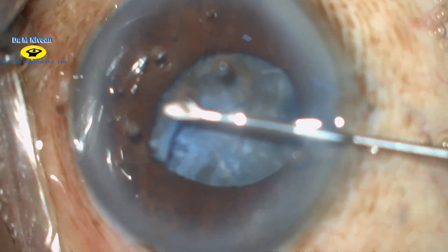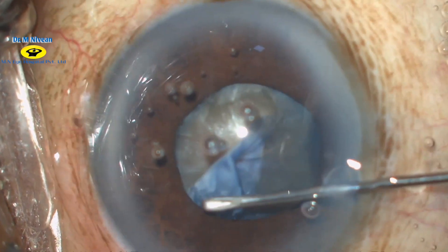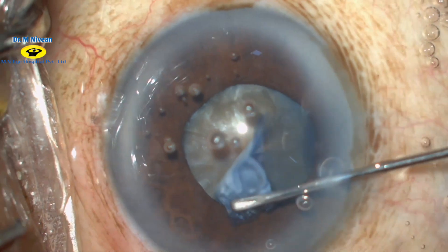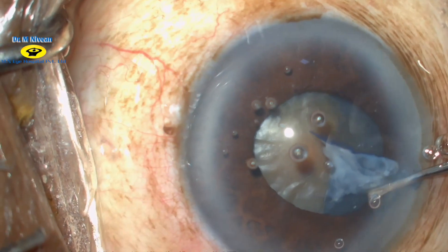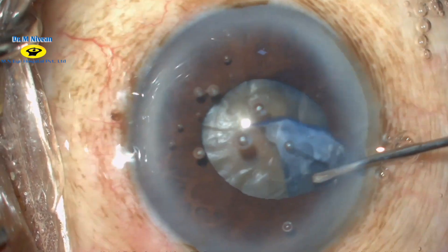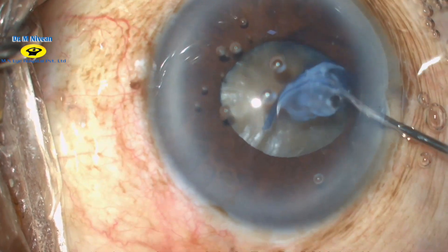As you can see, the capsulorhexis is performed under the iris. This is done to make sure of an adequately large rhexis. Special care should be taken to make sure that the capsulorhexis does not extend to the periphery and that it should be fully completed.